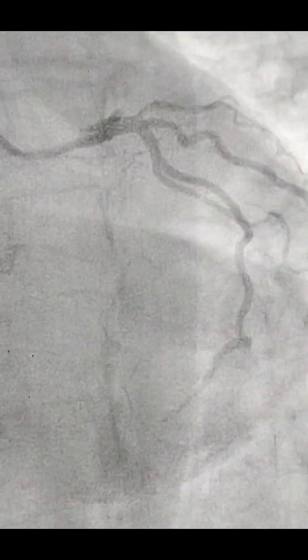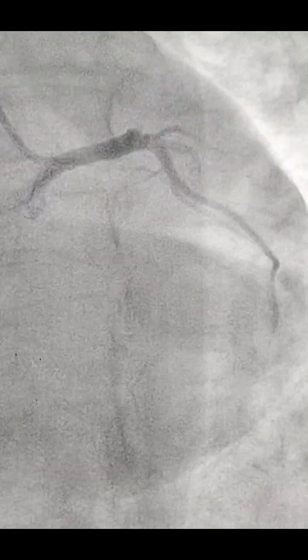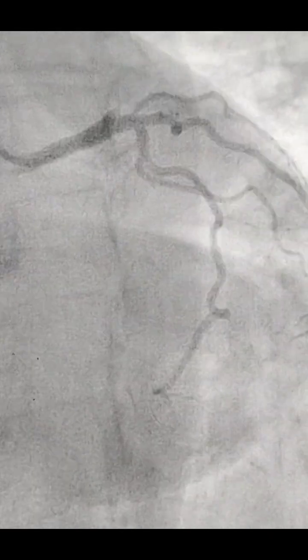Then this patient presented to us, and on arrival in the emergency, the ECG showed frank ST elevation V1 to V6 with reciprocal changes in the inferior leads, and on echo there is RWMA, severe LV systolic dysfunction, as you can see. After counseling, this patient was taken for the emergency PTCA, and this is the angio view.